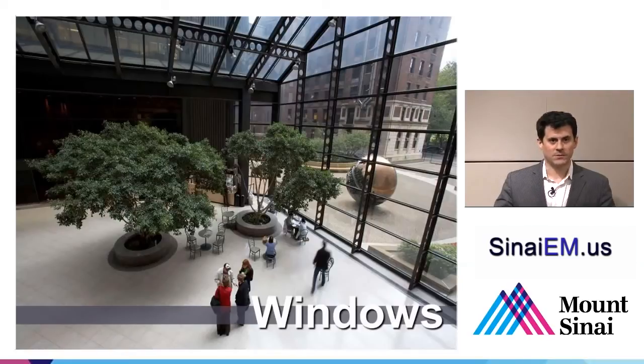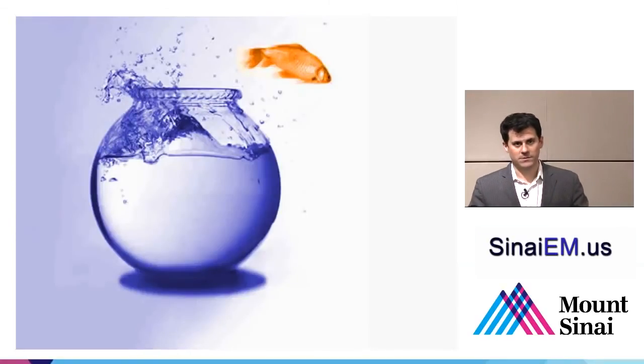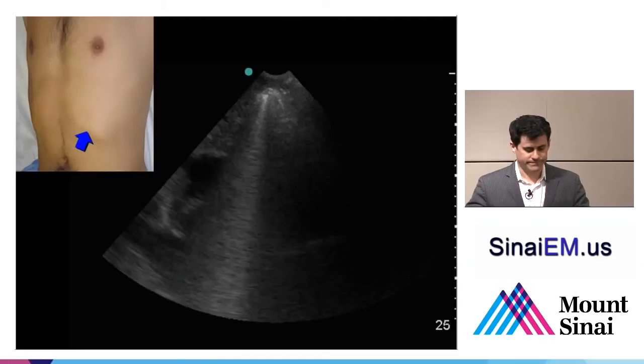So we already talked about sound from the ultrasound transducer starting off as a liquid density. So if you start off with a liquid dense transducer and you couple it with liquid dense coupling gel and you're going through skin and soft tissue, the next best thing you should try to image through is something that's also liquid dense within the body. So liquid dense structures in the body act as good acoustic windows to allow sound to pass through, so they can image deeper structures and carry that information back. So your ultrasound transducer is really going to seek water and hate air, just like this fish.